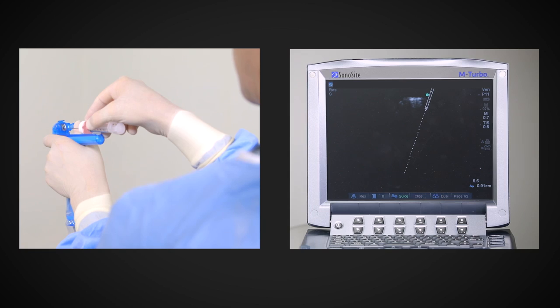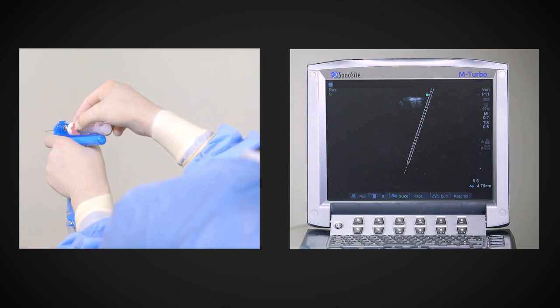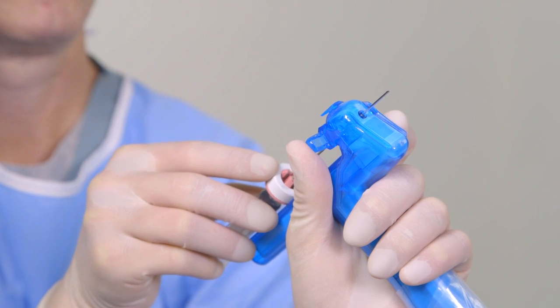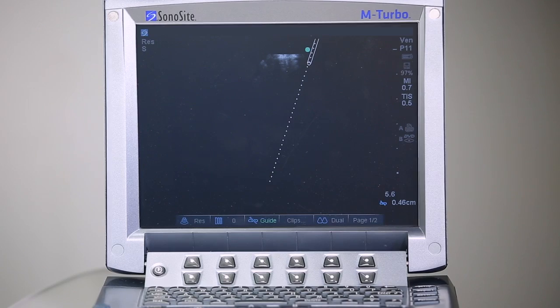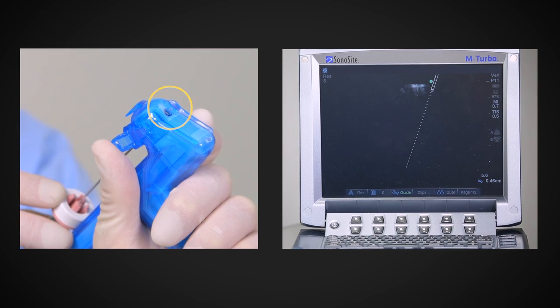With the needle in the guide, move the needle forward and backward. As you do this, confirm the needle movement is mirrored by the virtual needle movement on the sonogram. Now move the needle until its tip is just protruding from the base of the sterile shield, and confirm on the sonogram that the virtual tip is visible at the top of the sonogram. Observing that needle movement is synchronized and that the virtual needle tip is properly located on the sonogram confirms that the system is ready for use.